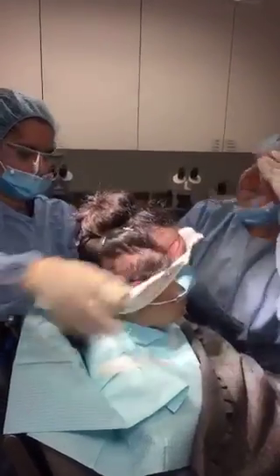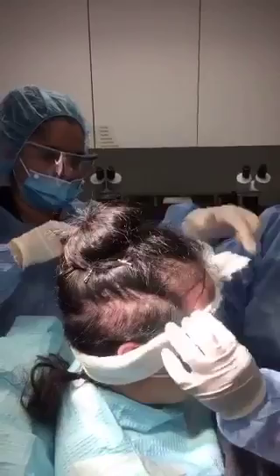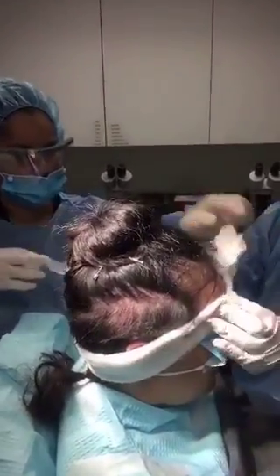We're done with local anesthesia. We call it ring block. We numb around the scalp, and the patient is going to be totally numb when we remove the strip of the scalp. Just a little, right over here. Oh, perfect.